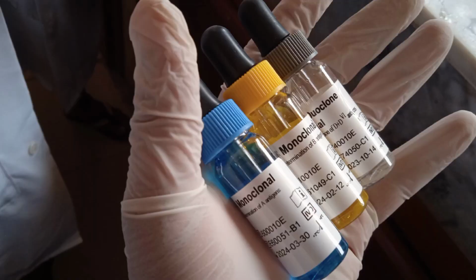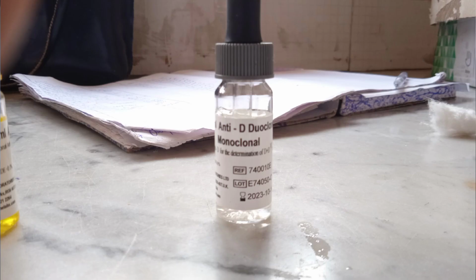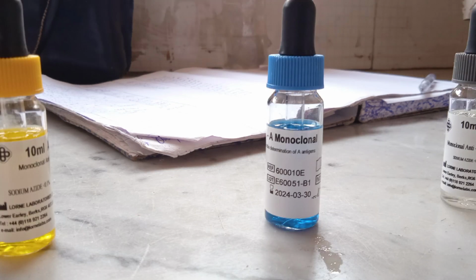This is a unit that deals with analysis of samples to diagnose diseases caused by defects in the blood cells. And these are some of the antisera we use in the laboratory. We have the anti-A, anti-D and anti-B. We use these for blood grouping in the hematology lab.